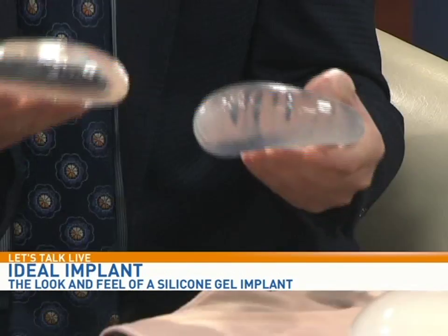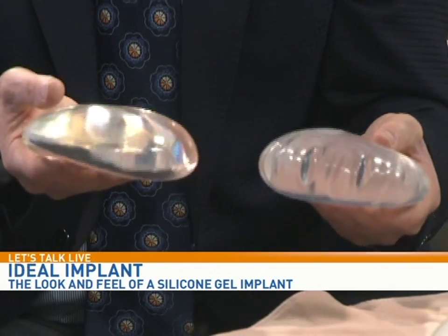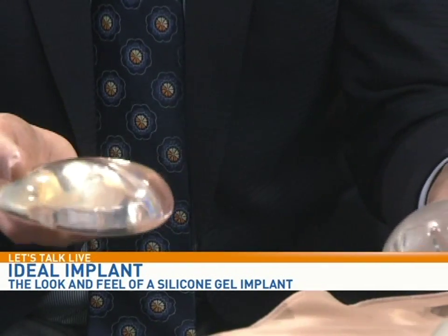Obviously, this is new technology. We started out, am I correct, with the silicone? Yes, silicone gel and saline implants have been around for decades, and there hasn't really been any change in the design until recently, until the new Ideal Implant. The majority of women choose the silicone gel implant because it gives the most natural feel. But it has issues, and as we know, nothing lasts forever. That's correct. Whether it's a heart valve, a knee replacement, or a breast implant, it's going to wear out. So when it does wear out, what does that mean for the woman that has the implant?